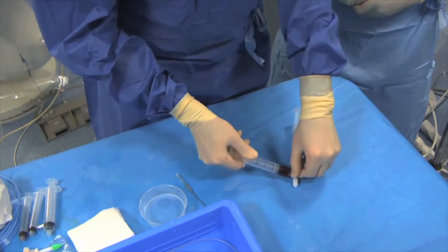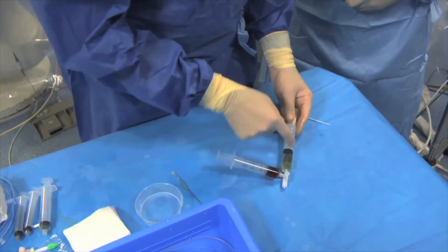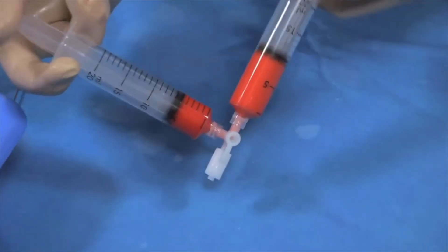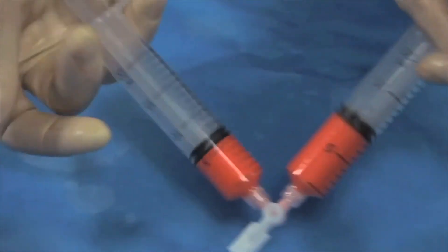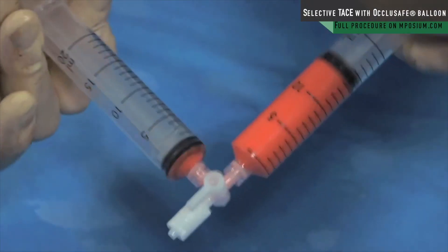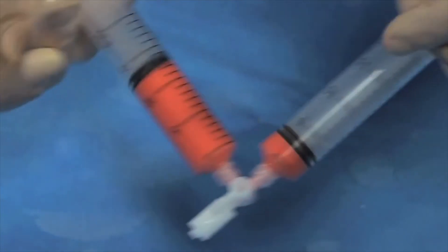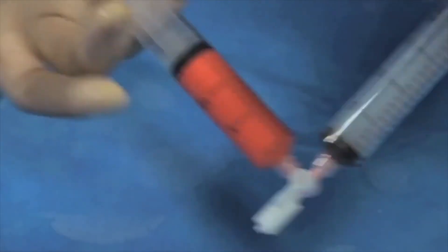The next important step when you prepare the emulsion is to push the doxorubicin towards the lipiodol. You have to do about 20 push-and-pulls of the syringe to get a droplet from the internal phase, which will be in the range of 70 to 150 microns.